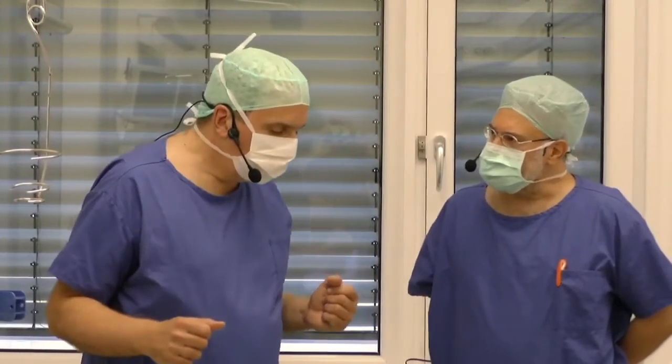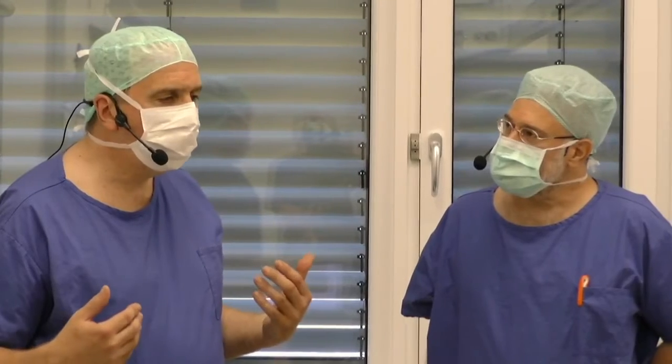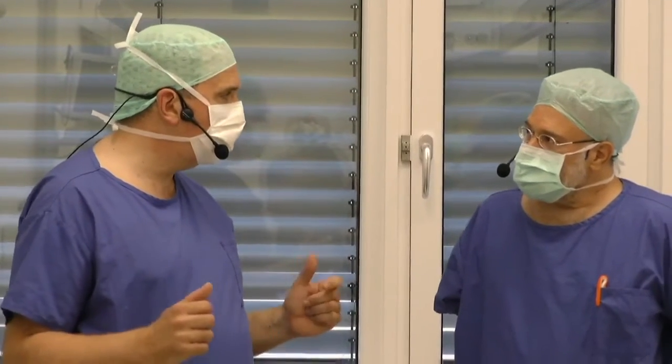So you feel that this lens system gives you more flexibility with younger patients? It gives me more flexibility with younger patients. It gives me more flexibility to adapt a system. I'm convinced that the visual acuity with two lens systems is better.